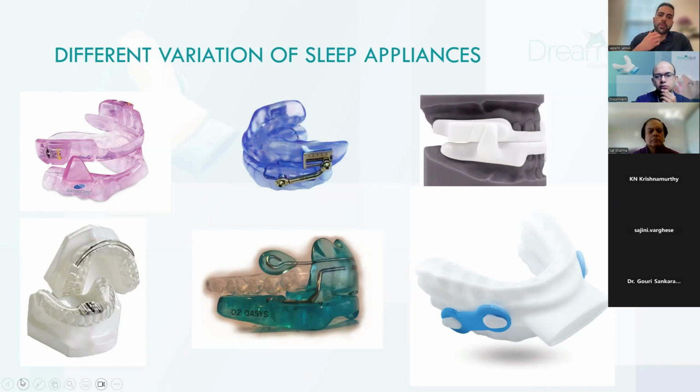And even then, if the patient could not breathe through the nose properly, or if they're a habitual mouth breather, they still couldn't breathe properly because we were not opening any air passage through the mouth. It was just bringing the jaw forward to keep the air going through the back of the throat, but the patient still had to have a good ability to breathe through their nose. And we see a big correlation between mouth breathing and people who have OSA. Usually they have a higher nasal resistance, and they have more difficulty breathing through their nose, especially when they go in a supine position. There are different reasons that have been postulated in the literature.